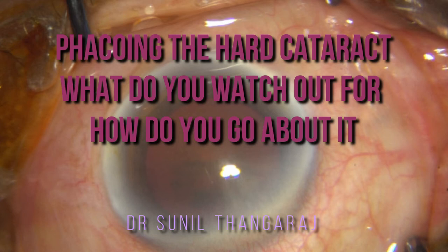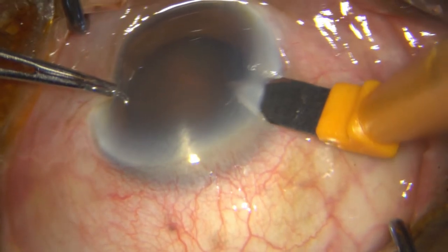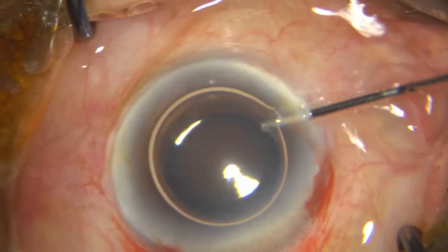This is a FACO in a very hard cataract — almost a grade 4 to grade 5 nucleus sclerosis. After making the incisions, I stain the capsule with Trypan Blue, then expel both the Trypan Blue and the air with 2% HPMC.